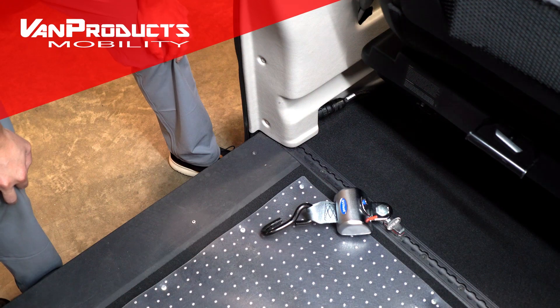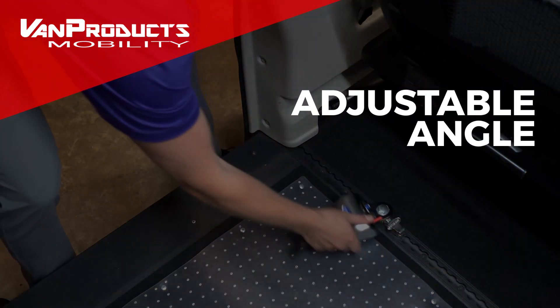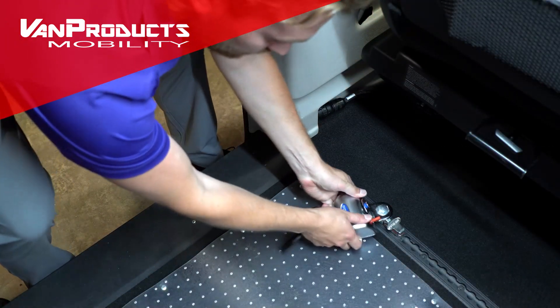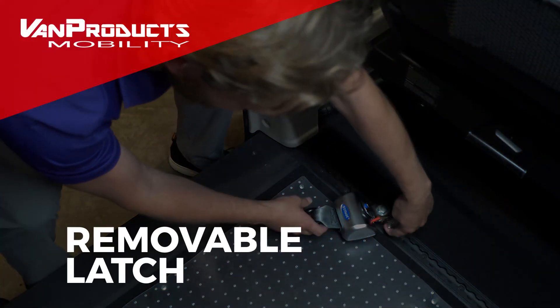In order to ensure the safety of the wheelchair user and all other passengers in a vehicle, you will need to make sure that the wheelchair is not going to move. In order to do so, you will use these Q-Straint retractable tie-downs to secure the wheelchair.